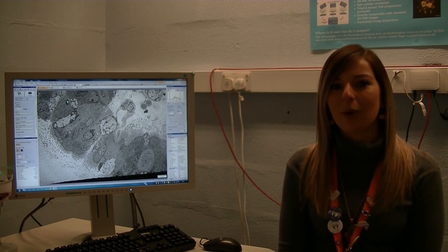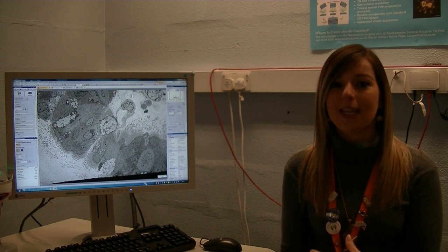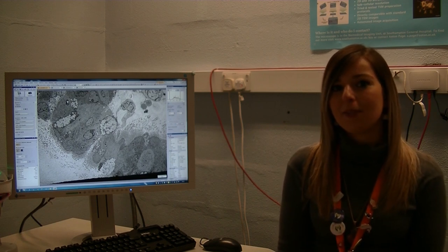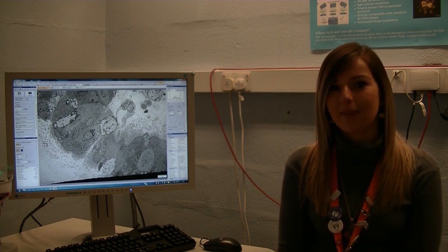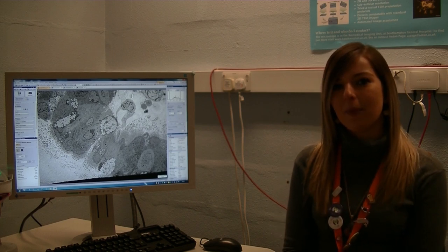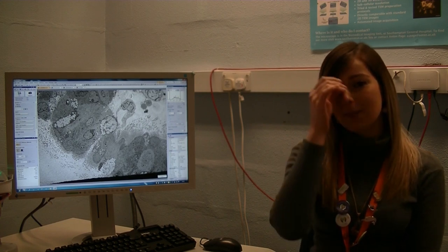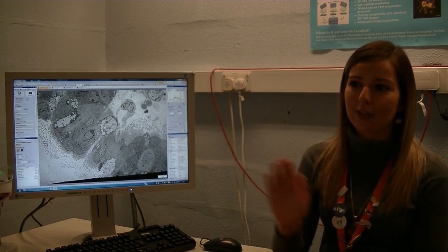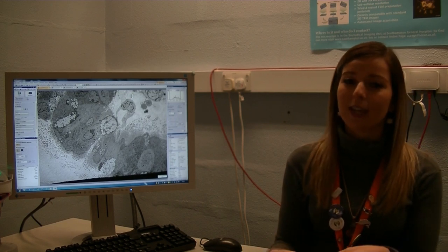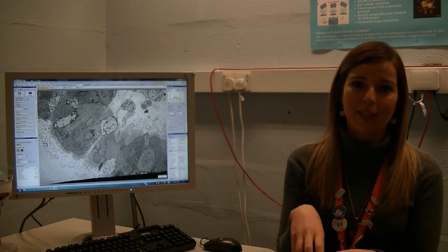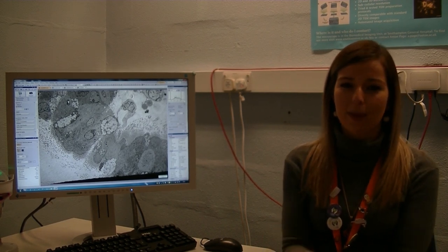PCD is where the hair-like structures in your airways and nose, called cilia, don't move properly to allow evacuation of mucus and bacteria from the airways. Once the sample has been cut and prepared using ultramicrotomy, we can insert it into the transmission electron microscope, or TEM, and this allows us to look inside the cilia to look at their structure and see if there's anything defective about it.